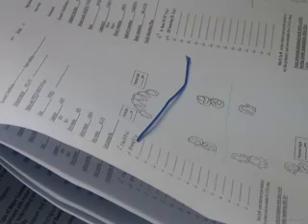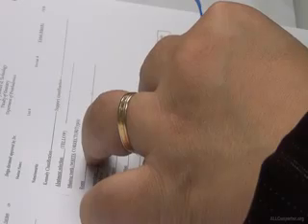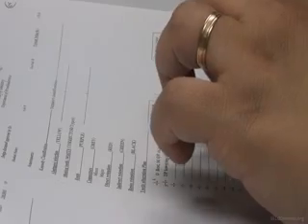Go here. In this case, do I have quadrilateral support? No, I have to add components for indirect retention. This is a tripod design. Here, with tripod design, meaning I have a rest here, a rest here, and a rest here. So this is my principal fulcrum line, and this is the indirect retainer. But do I need to add for indirect retention? No, I added for another reason, which is cross-arch stabilization. It's not for indirect retention.